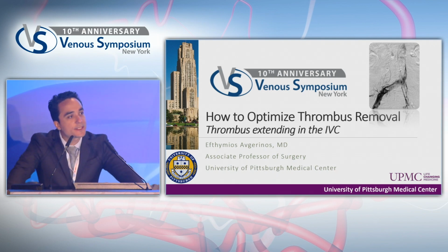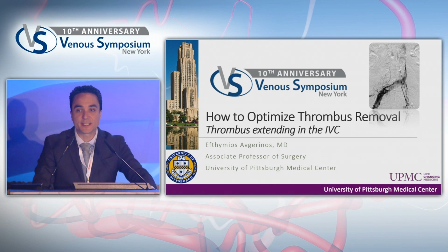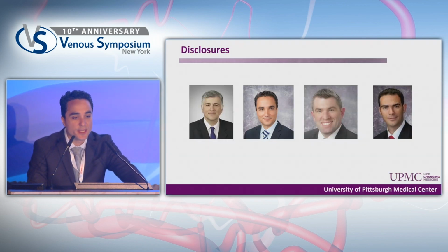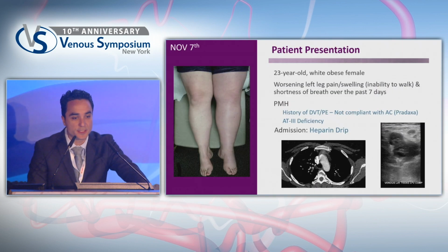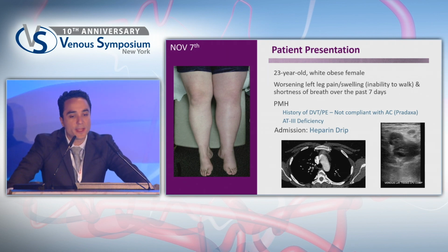So I'll discuss how we can optimize thrombus removal for thrombus extending into the IVC. These are my disclosures. And this is a case that had multiple interventions, so several of my partners were involved in these interventions. So we have this 23-year-old white obese female who has worsening left leg pain and swelling.